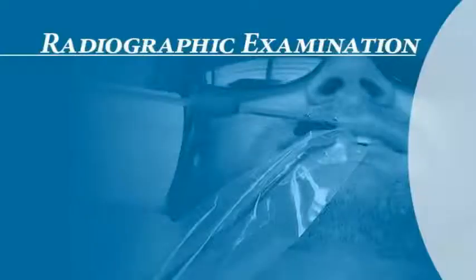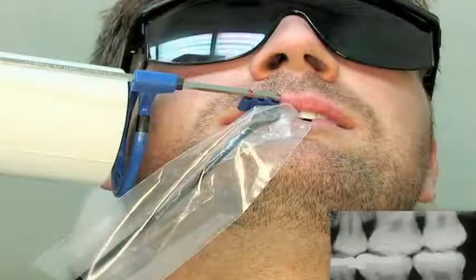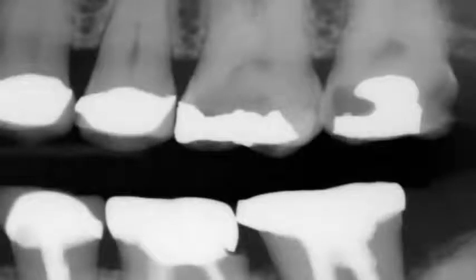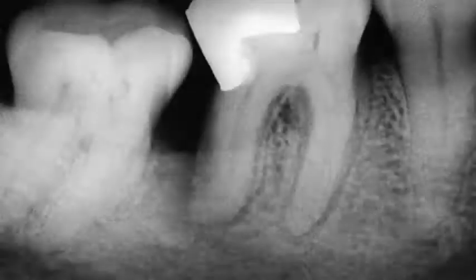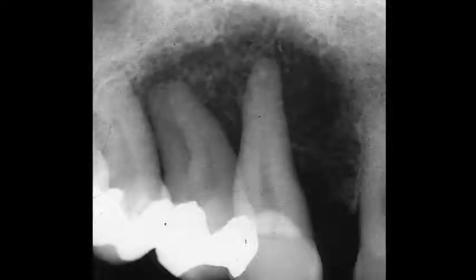Radiographic examinations. Periapical as well as bitewing radiographs are essential for the examination of mineralized tissues. Radiographs allow detection of carious lesions, defective restorations, quality of root canal treatment, abnormal pulp and periapical appearances, the relationship of the neurovascular bundle and maxillary sinuses to the apexes, and any bone loss due to periodontal disease. They may also reveal structural changes and bony disease unrelated to the teeth.